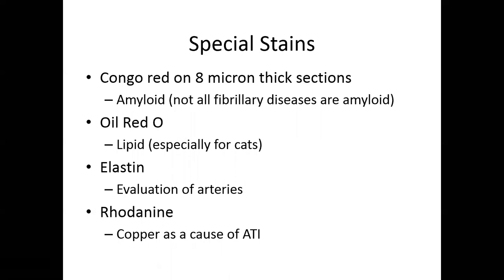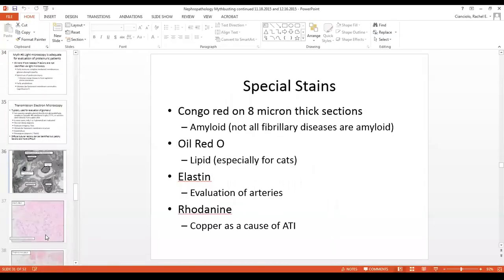And so if you guys can remember, and I think I do have pictures later in the presentation, about the trilaminar structure of the glomerular basement membrane. The reason it's trilaminar is you have both the epithelial cell and the endothelial cell making basement membrane, and then the middle part of it fuses to make the lamina densa. So I'll just, let's see, how do I go back out? Okay, so we'll just really quickly.